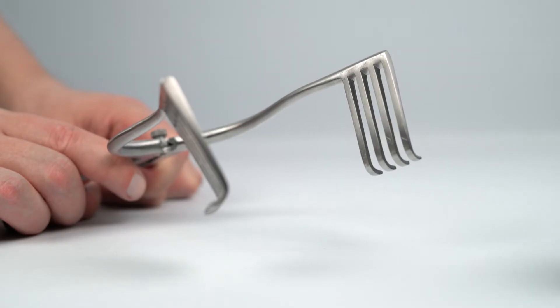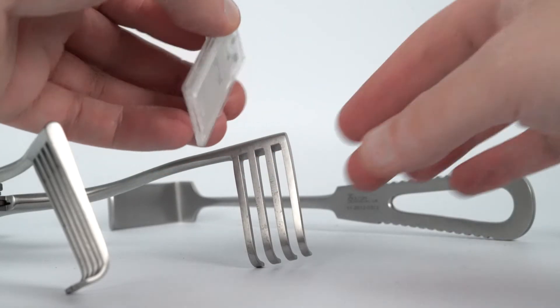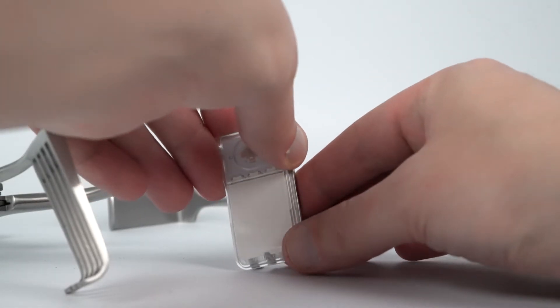Begin to line up your flat-bladed retractor, ready to have your OpLite affixed to it. Once you're happy with the alignment, press the OpLite against the tool and hold it in place.